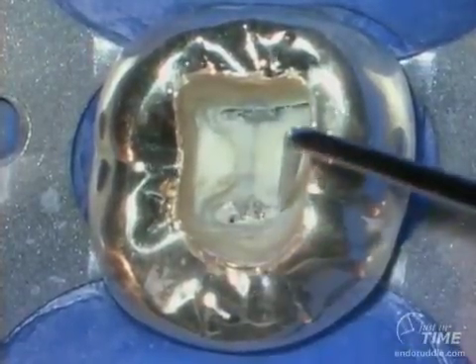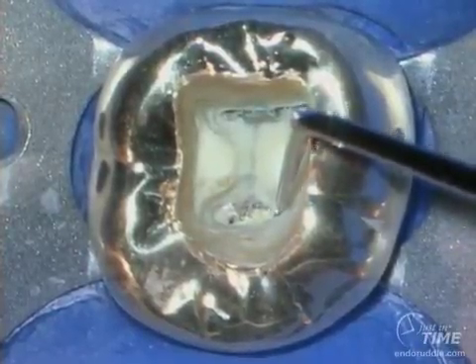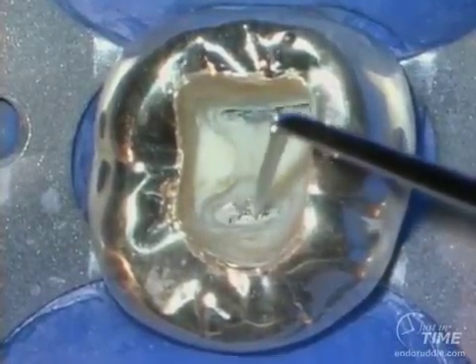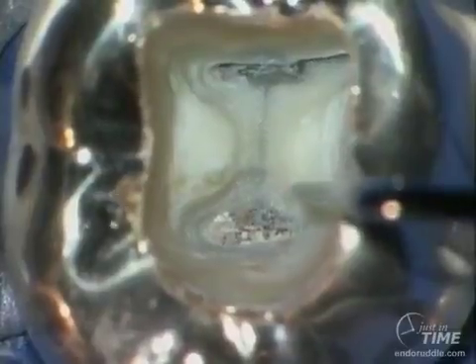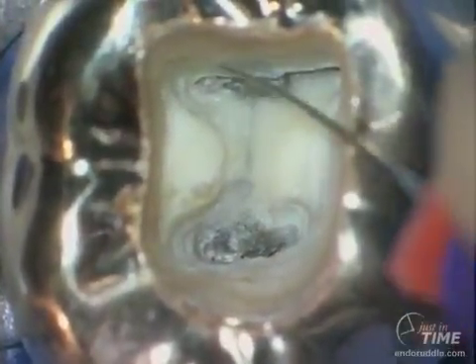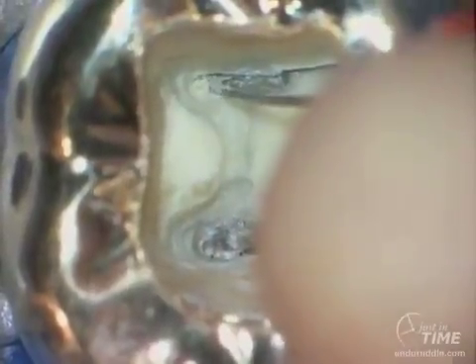You can notice that there are more denticles overlying the distal systems, and an explorer is beginning to tease out a small denticle that could inadvertently get pushed deeper into the canal if we don't take the time to thoughtfully remove these stones. Air evacuation can blow them out once they're free. Recalling that in endodontically involved teeth it is normal for orifices to constrict and recede — we must be very careful that we remove even stones that lie slightly below the pulpal floor.